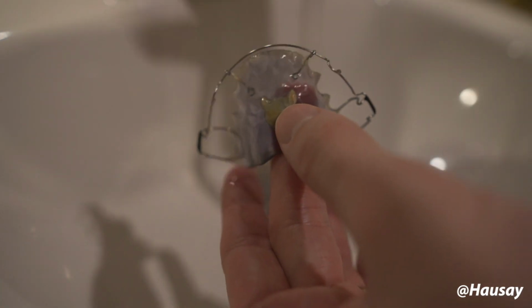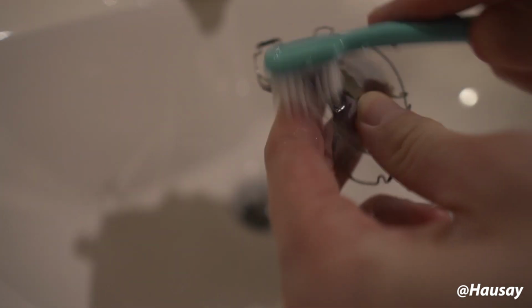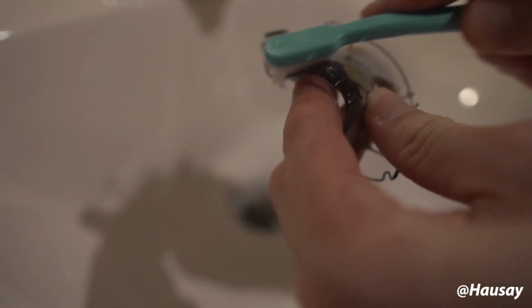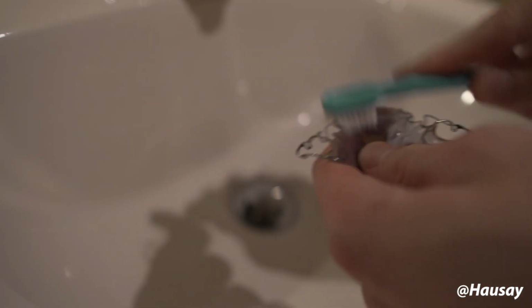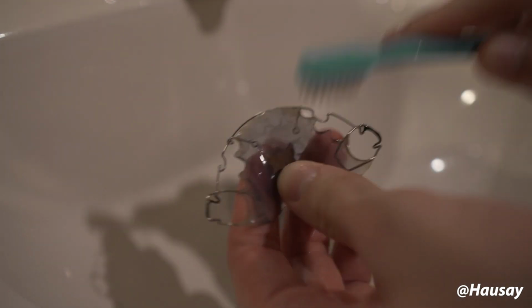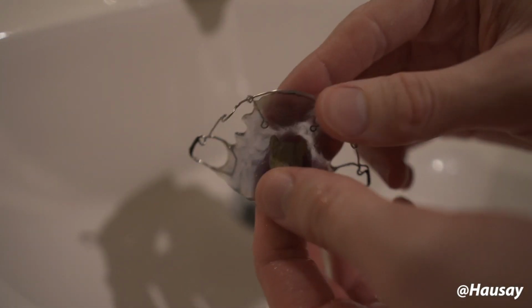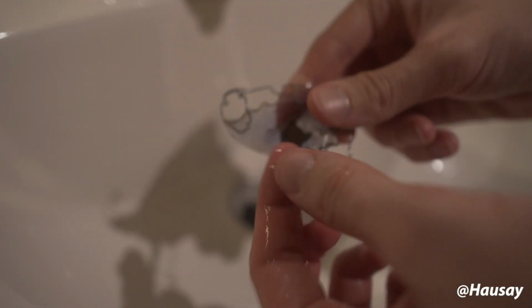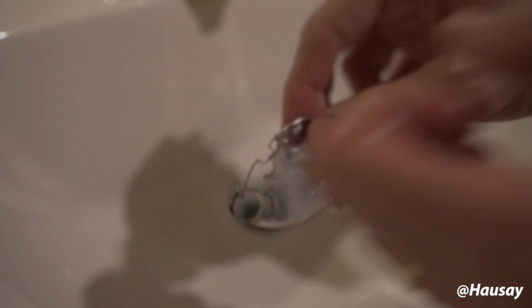So here it is. The next step, you're just gonna want to take your toothbrush and give it a good brush. Really buff out everything that loosened up in there. And then just give it one final rinse. And there we go. I mean, it's definitely not brand new, but it's for sure an improvement.